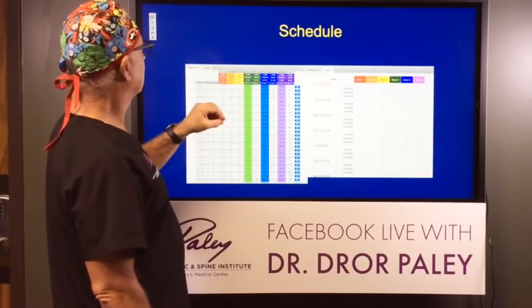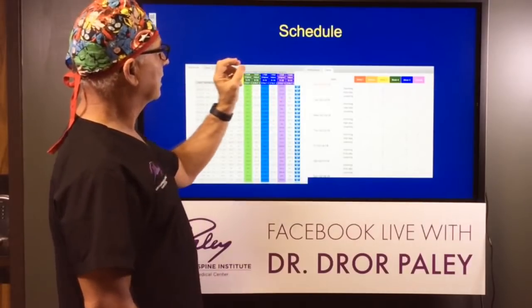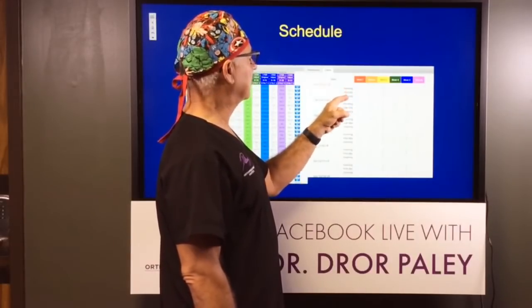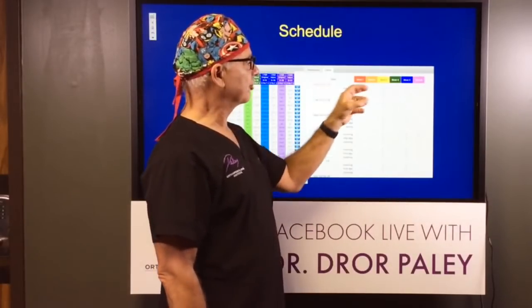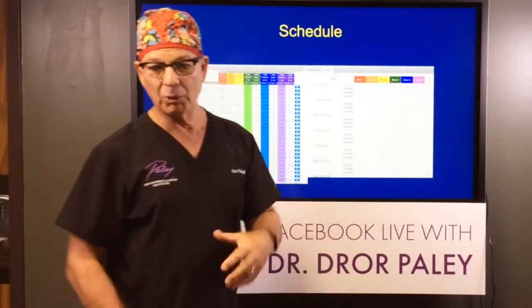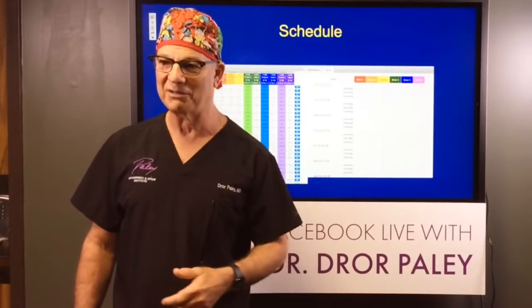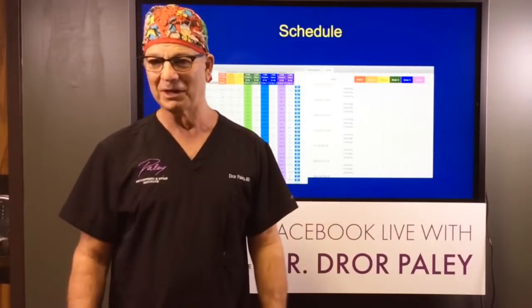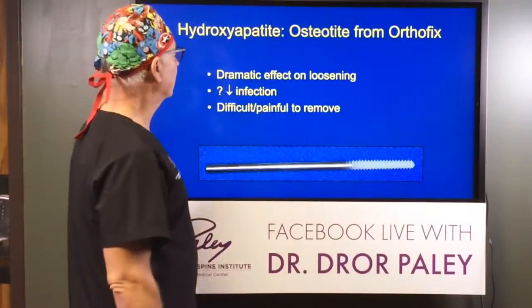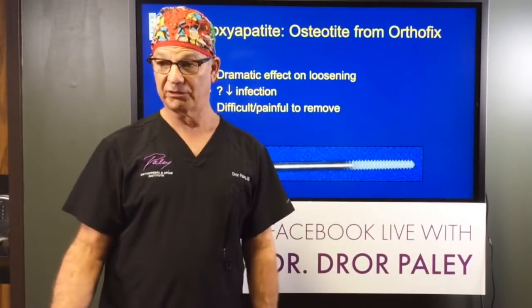way. External fixators rely on pins. We always talk about the fixators, but we forget to talk about the most bothersome thing of all, which is the pins. The pin technology has advanced a lot. One of the problems with pins is they go through the skin and the muscle, they anchor into the bone, and they loosen, and then they get infected. If you can't get a good anchor on the bone, and it loosens from the bone, then your fixator is loose and painful and so on.